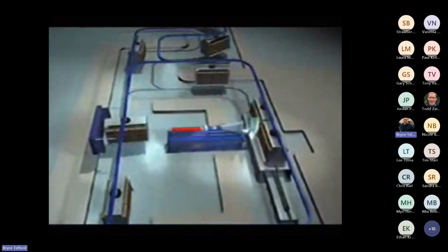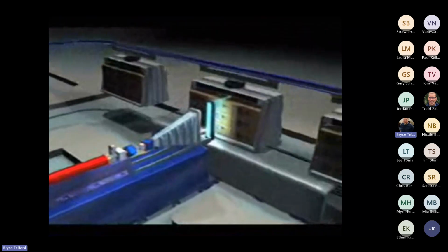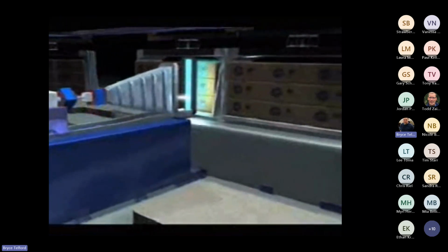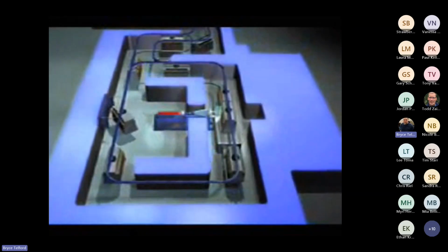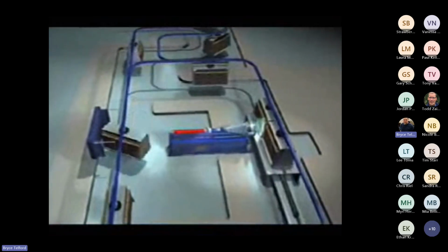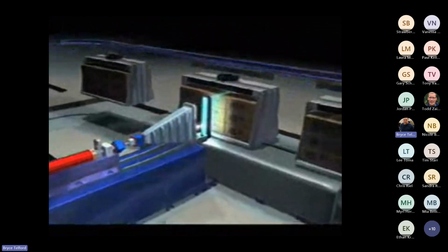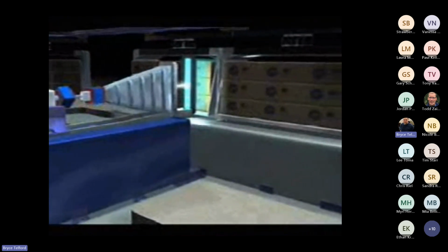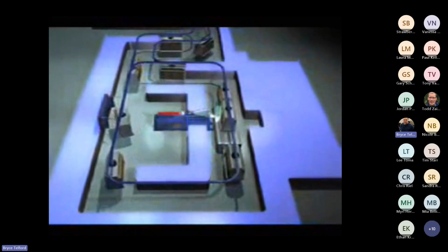It is fairly fast through the chamber. However, it is a much lower density. So we're only doing a few boxes at a time, for example, one or two, maybe two boxes thick. So generally, overall, even though electron beam is faster, overall throughput between gamma and electron beam tends to be comparable from one modality to another, because while the one's faster, it's doing less. The other one is slower, but it's doing more in bulk.